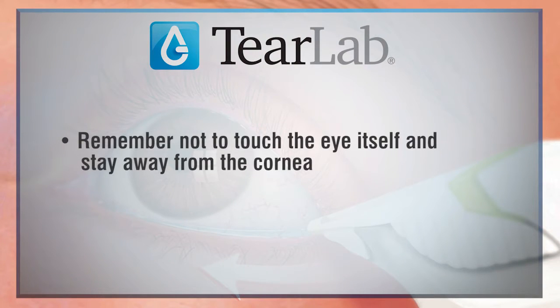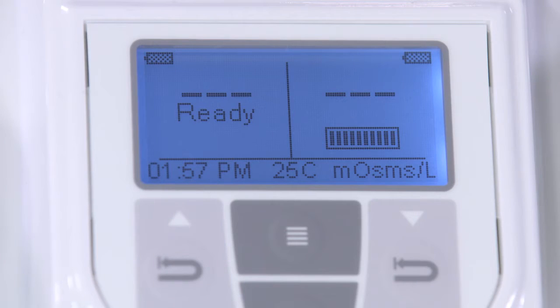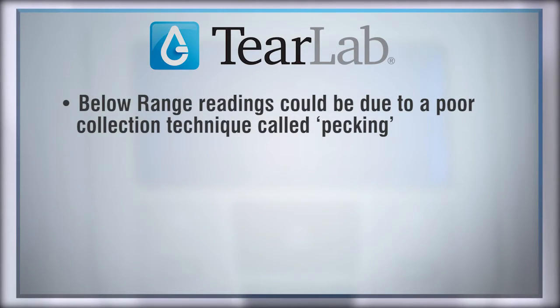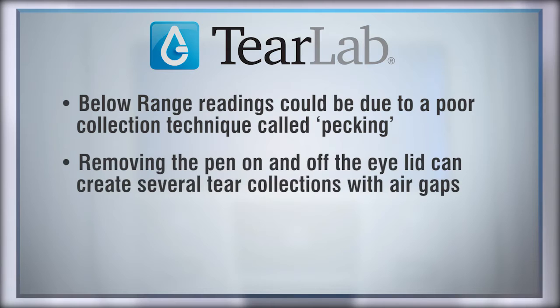Remember not to touch the eye itself and stay away from the cornea. If you get frequent below-range errors, this could be due to a poor collection technique called pecking. Removing the pen on and off the eyelid and then on again can create several partial tear collections with air gaps that result in a below-range reading.